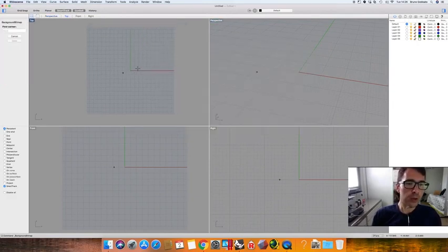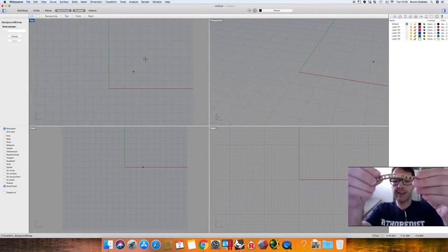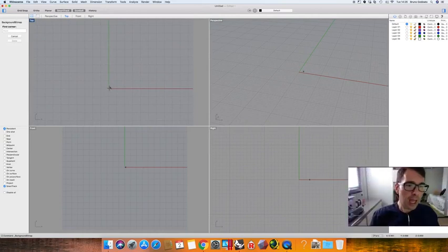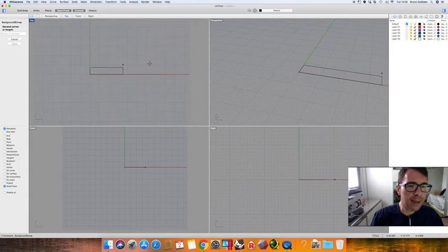And now we choose where to place that cropped image. I'm going to choose the top view, as we're going to see from top, just like that. This is the view we're going to have. I'm going to place it just in the middle and end that just at the end.